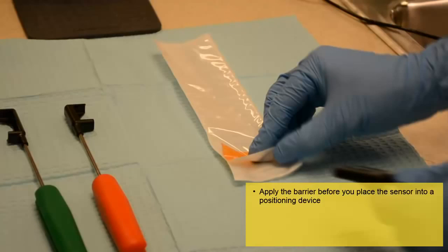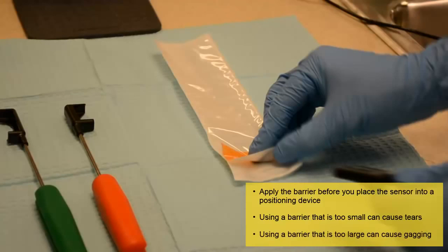Using a barrier that is too small could cause tears, which can contaminate the sensor. Using a barrier that is too large can cause discomfort to the patient and can trigger a gag reflex upon placement.